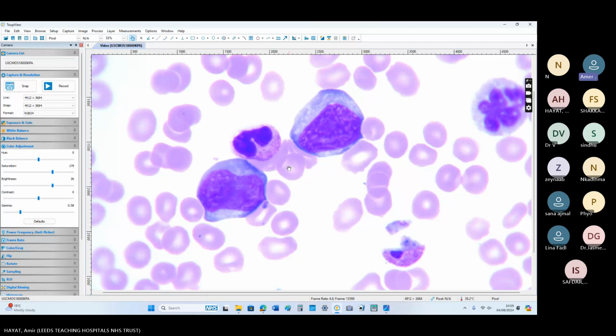Right. But if they have given you some other information, like if they say that this patient is MYC positive, TP53 positive on molecular studies, then how would you refine your diagnosis? If c-MYC positive, not quite sure about the TP53, but if c-MYC positive and Ki-67 is more than 98%, then Burkitt will be the diagnosis here.